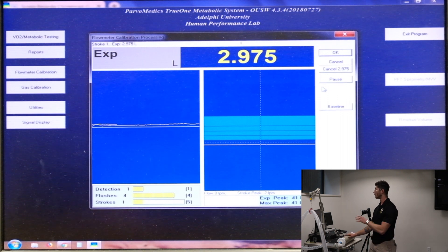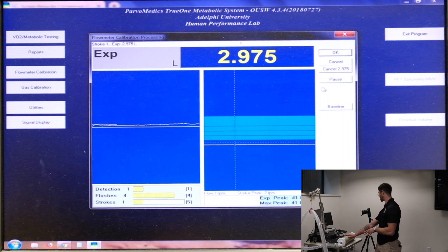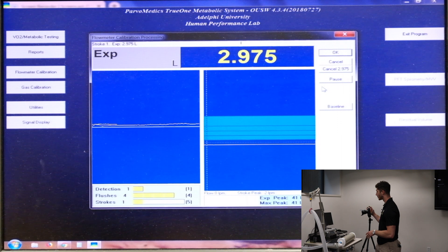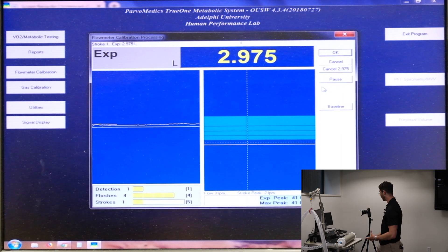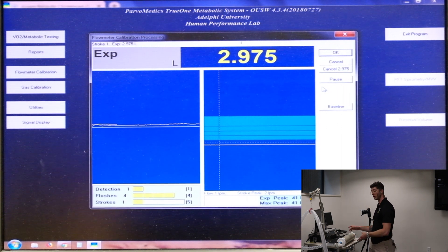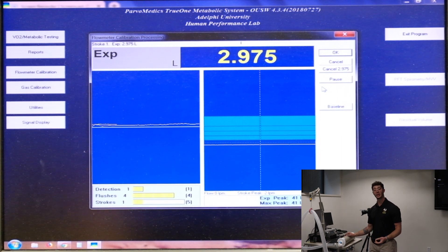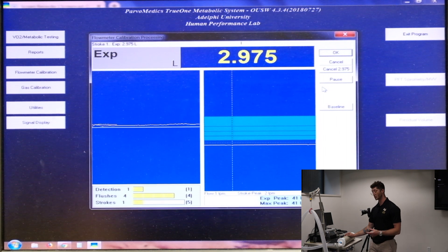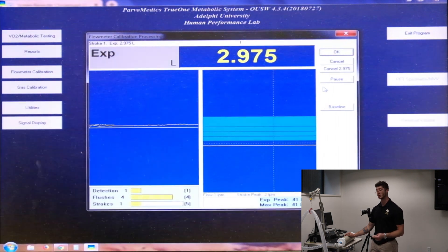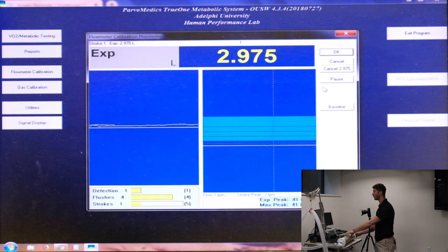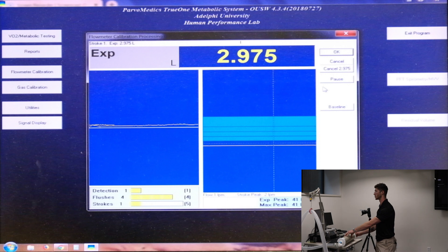Now, 2.975 liters is not exactly correct. We know that there are three liters of air going through the system. And so we have to correct for that later on. That's what the system is going to do with this calibration.